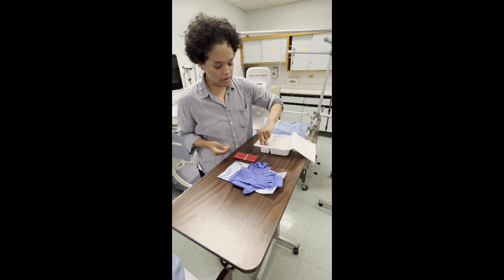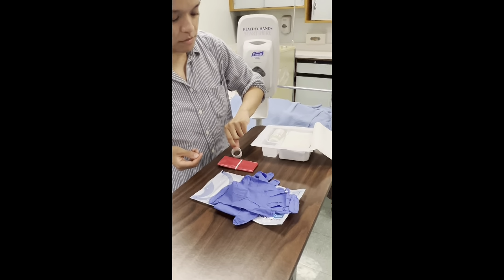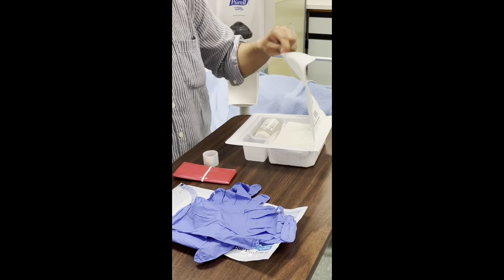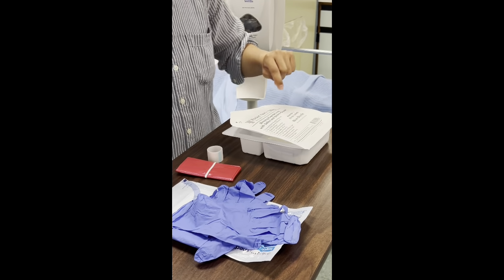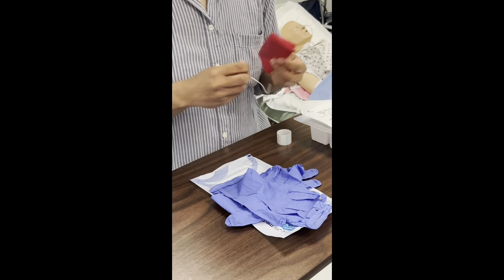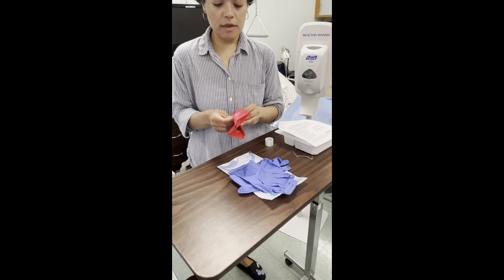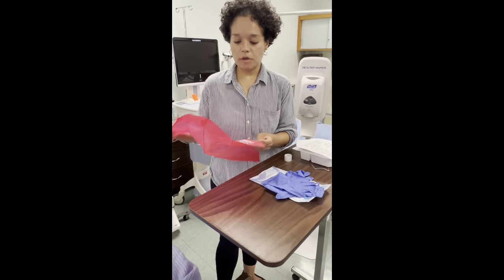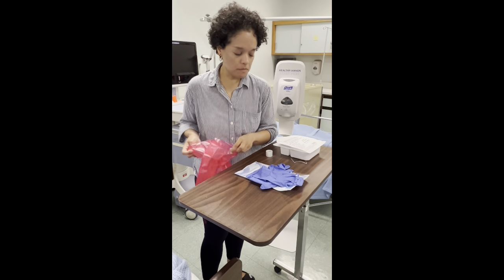And then you'll need tape. I'm just going to close. Okay. So now I am preparing the bag, which will be closest to my patient so that we prevent cross-contamination.